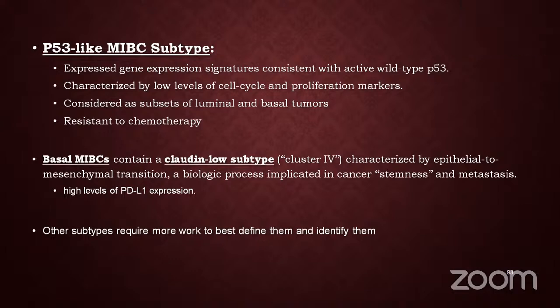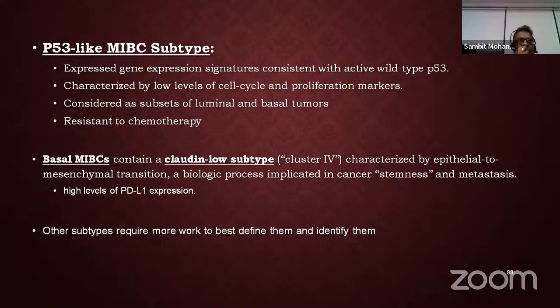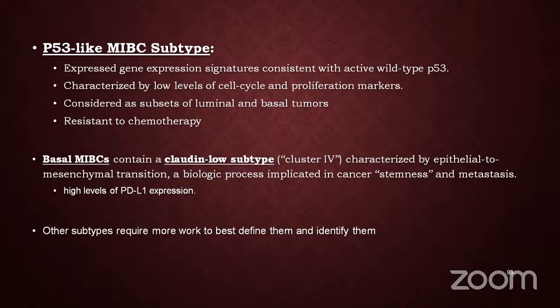Is there any IHC marker to differentiate? No, IHC doesn't help. GATA3 is going to be positive in squamous as well as urothelium. Pancytokeratin, keratin 5/6, P40, P63 would be positive for both. Squamous and urothelium have very similar, or I would say the same, immunophenotype.